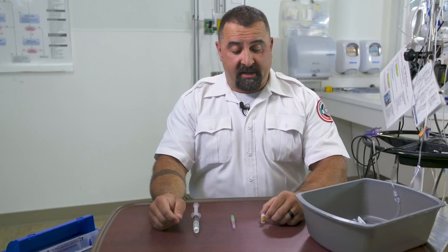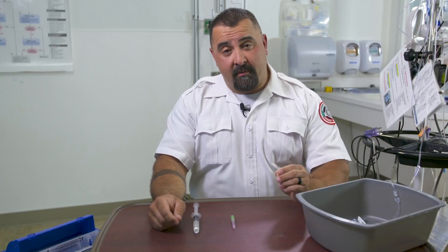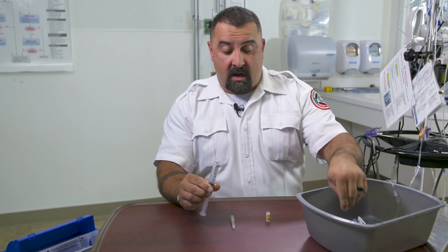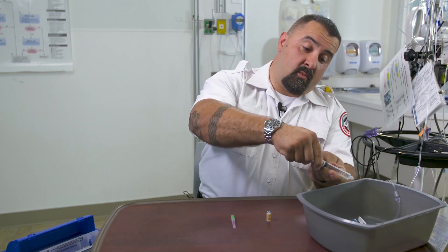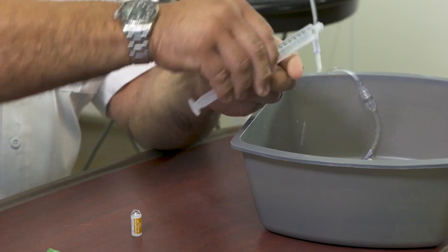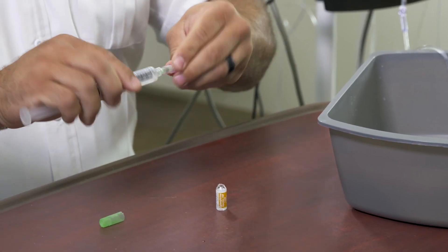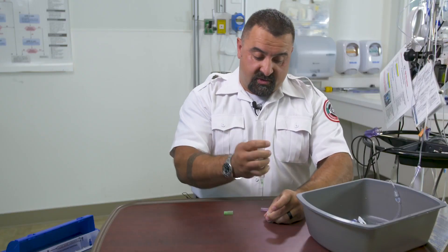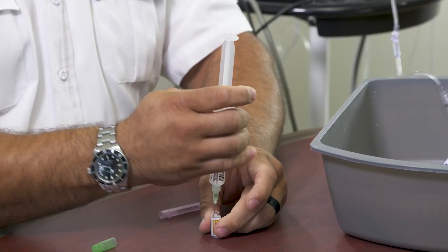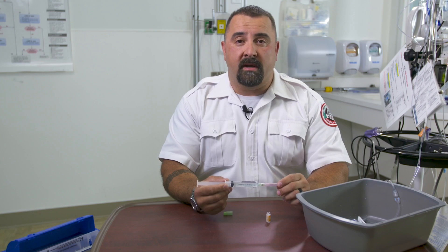We're going to be converting the 1 milligram per milliliter of epinephrine into a 0.1 milligram per milliliter solution of epinephrine. We expel 1 milliliter from a normal saline preload, then using our filter needle we draw the 1 milligram of epinephrine. We now have a concentration of 0.1 milligrams per milliliter.